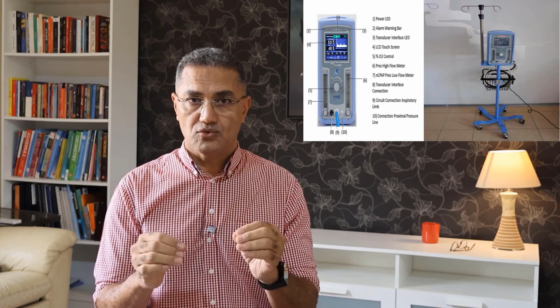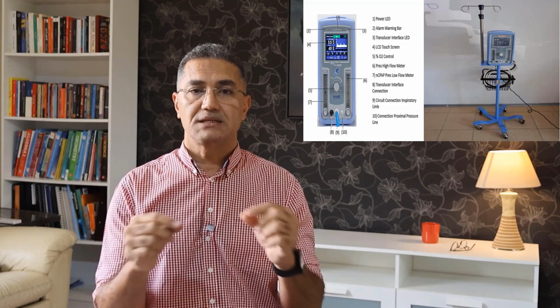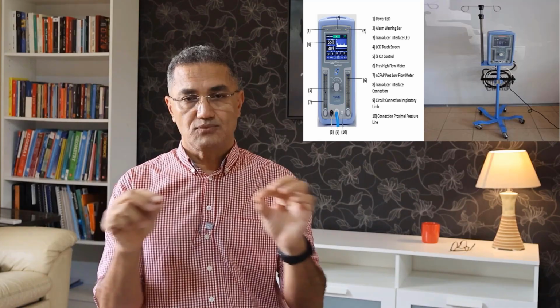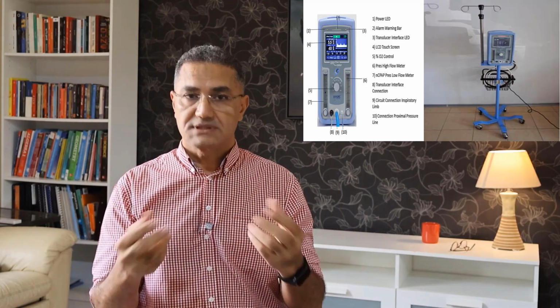And please remember that CPAP is not a machine. CPAP is a mechanism. What does mechanism mean? CPAP stands for continuous positive airway pressure. It means you provide the patient with a single level of pressure, and that single level is called CPAP.